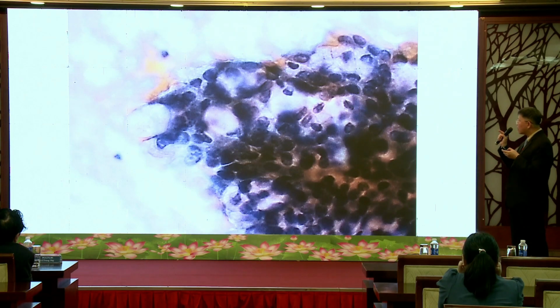Because I made a very quick diagnosis in this case, when I saw the myxoid material, I was very confident this was pleomorphic adenoma. But be careful. This is the lesson I want to share with you.